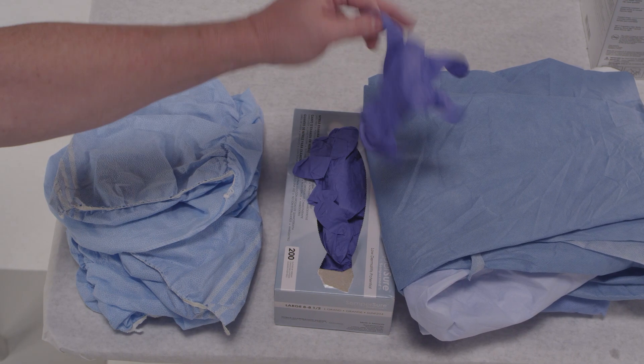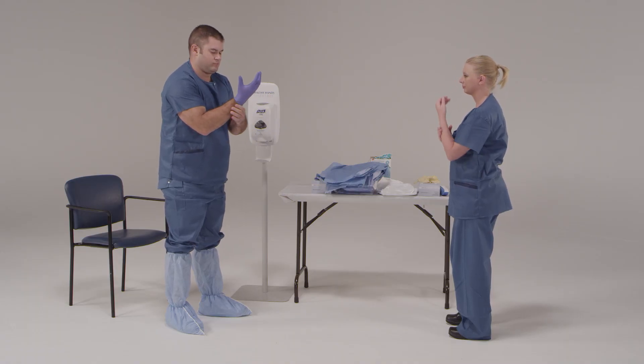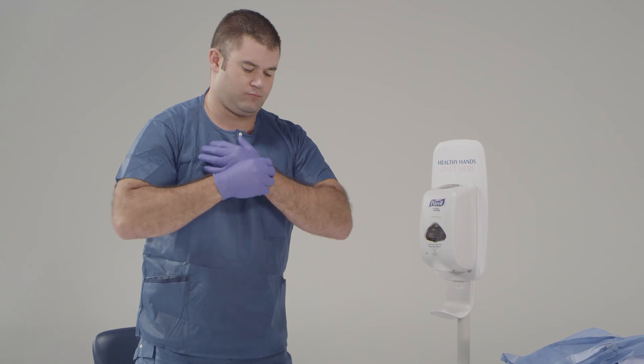Now we're going to put on our first pair of gloves. Do this as you normally would — it does not need to be done in a sterile fashion. Make sure that the cuffs of the gloves go as far up your arm as possible. These are going to be called your inner gloves.